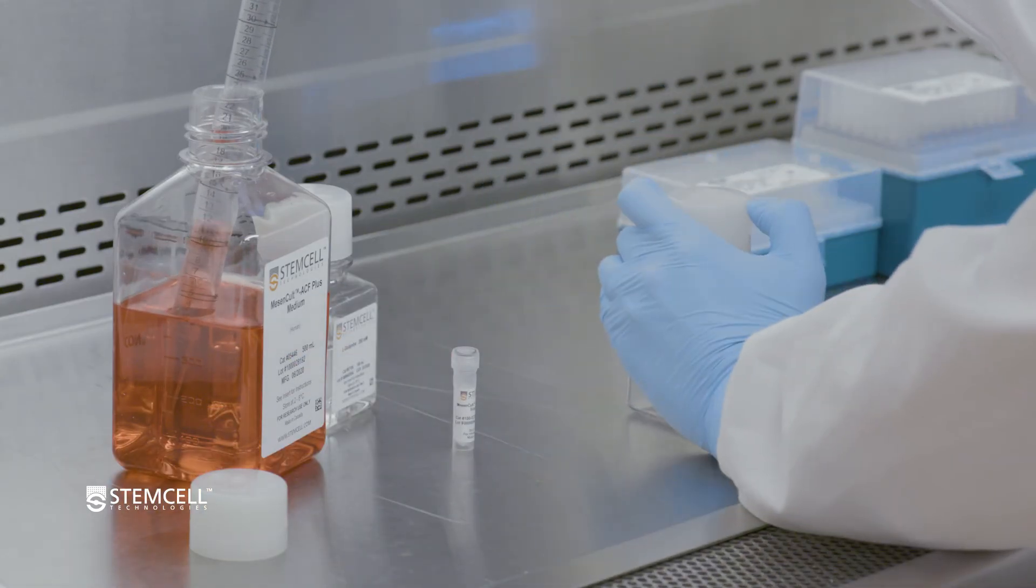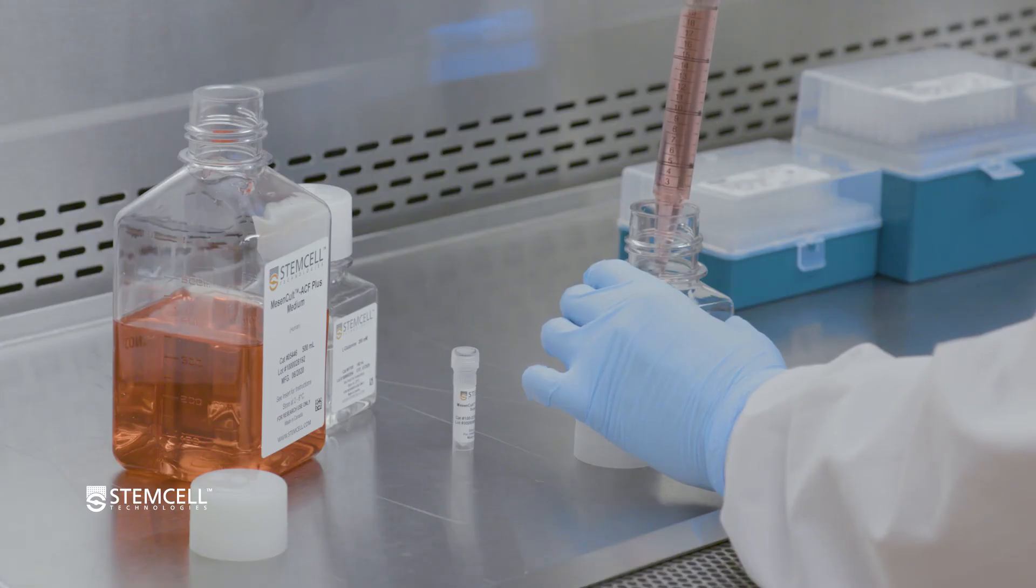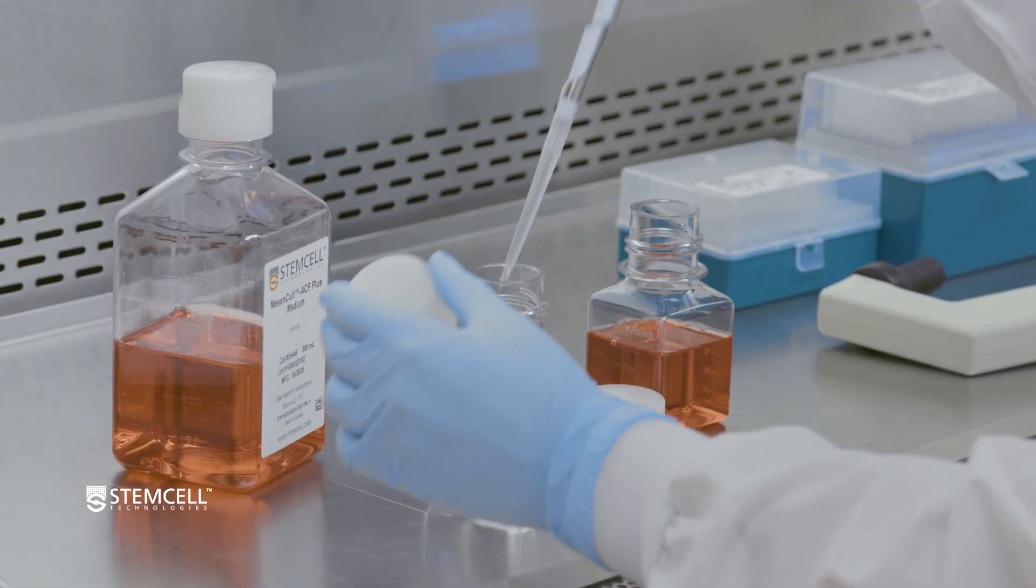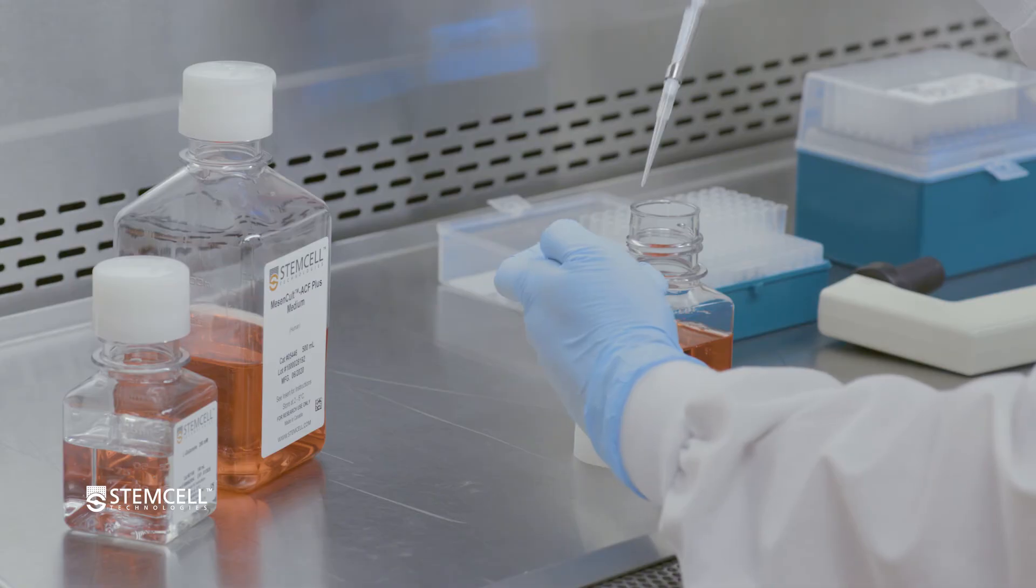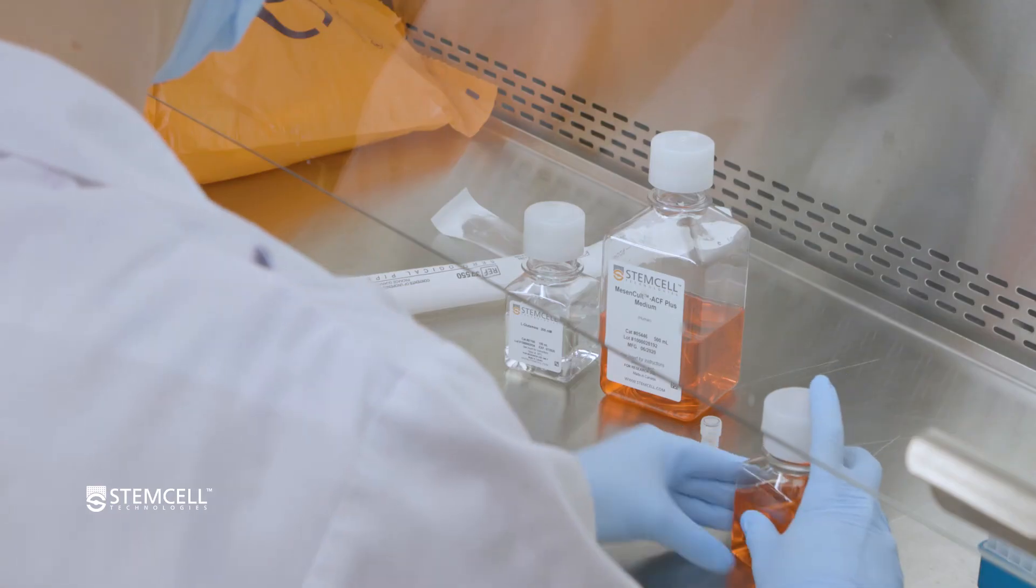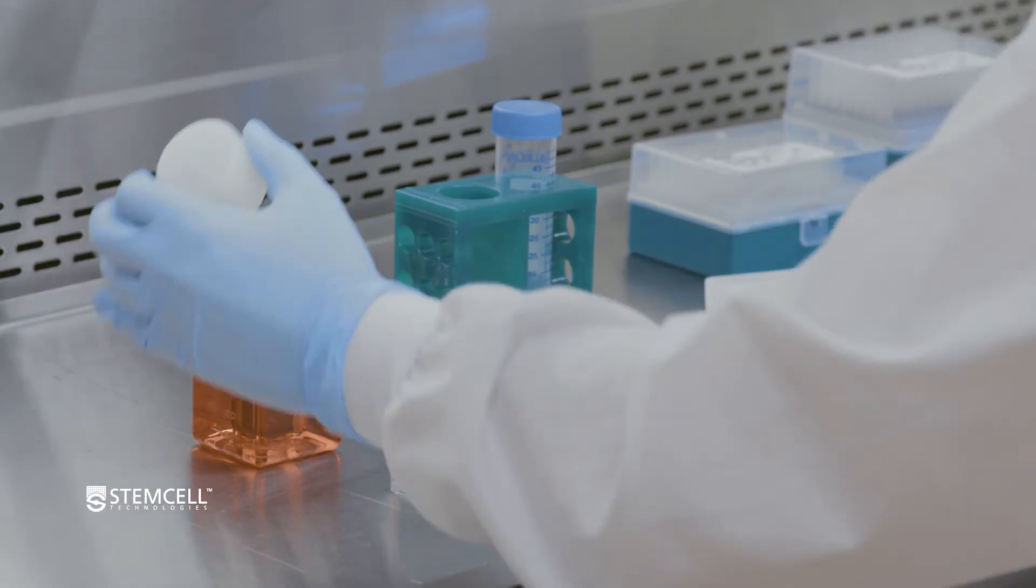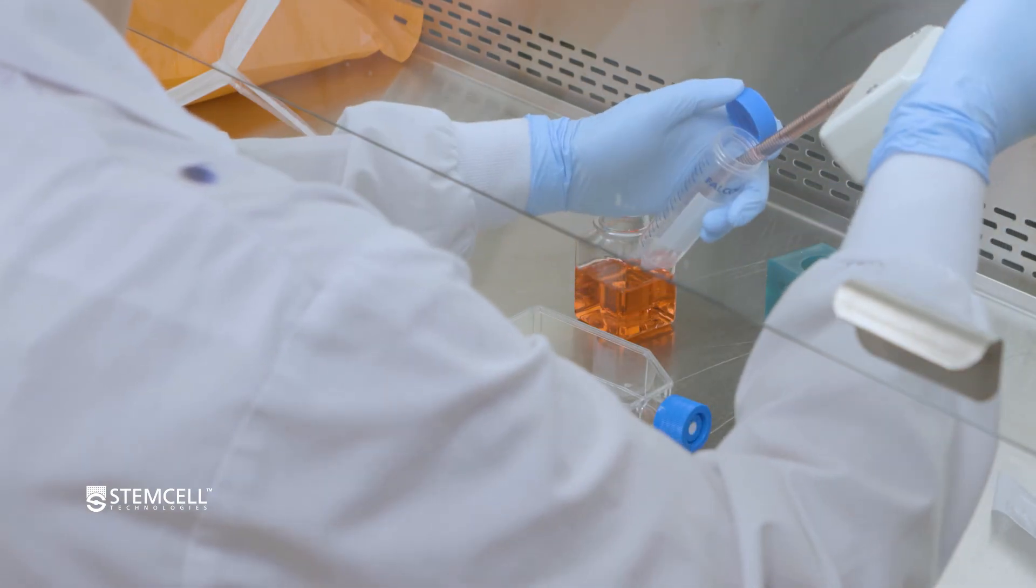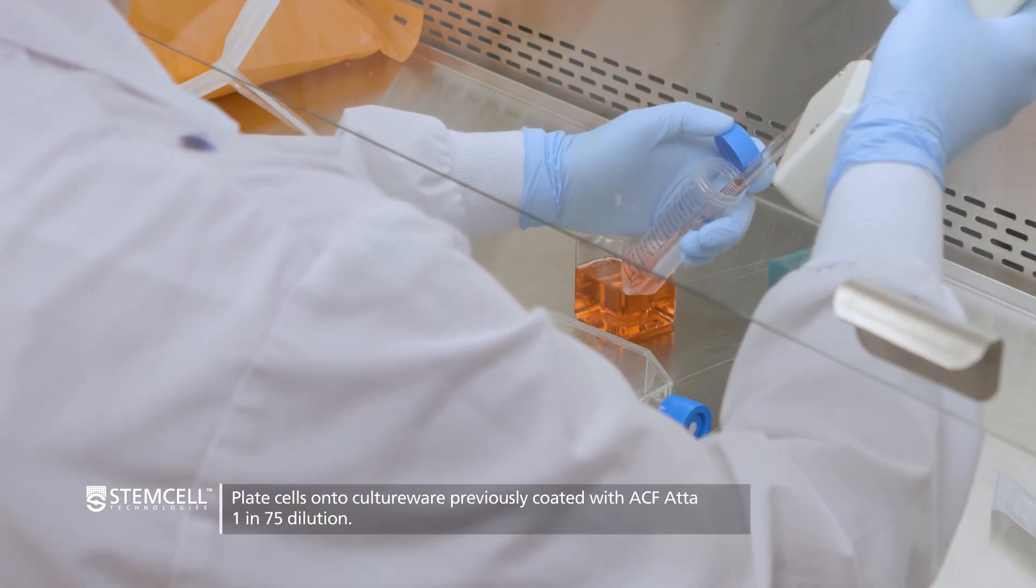Umbilical cord MSCs should be expanded in MesenCult ACF Plus medium. Prepare the required amount of complete medium by adding MesenCult ACF Plus 500X supplement and L-glutamine to MesenCult ACF Plus medium. Re-suspend the cells in complete MesenCult ACF Plus medium at the appropriate concentration to maintain 1,500 to 3,000 cells per cm2 surface area. Plate cells onto coated culture wear.